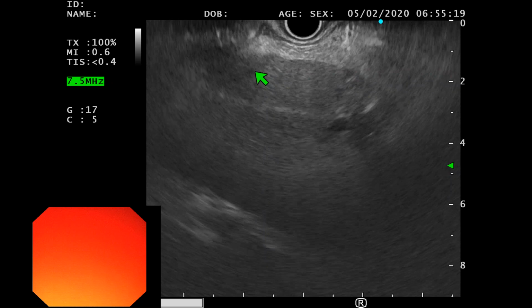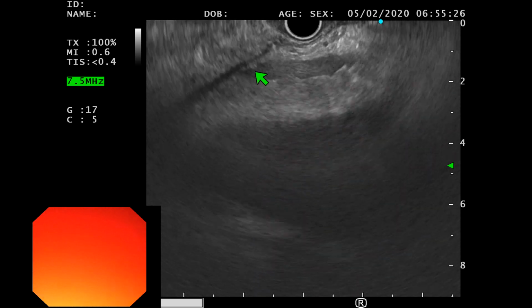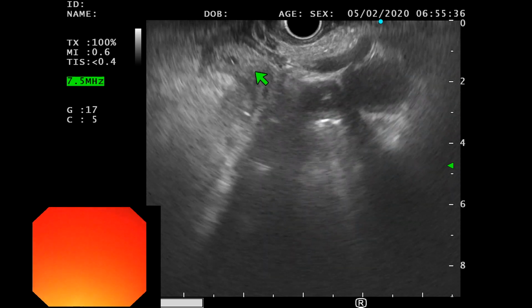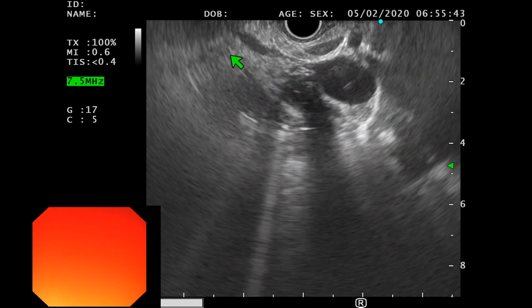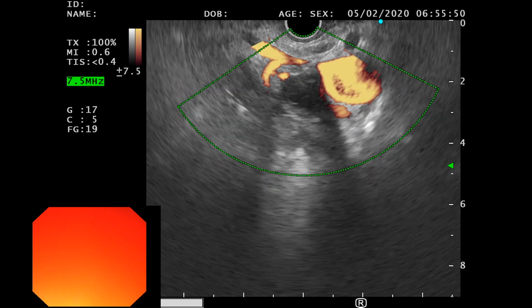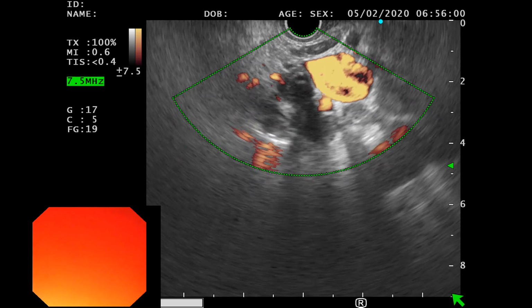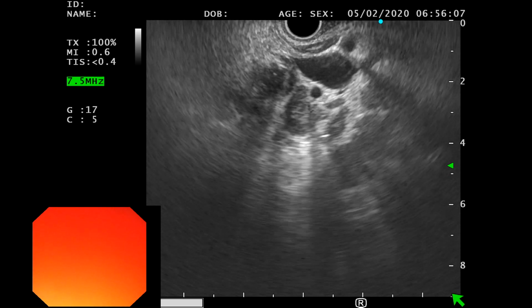We'll go back to the liver. You lost. So in the liver, when you're looking at the liver, we should be able to see the ductal system is dilated. Okay. Keep following the liver here. Keep going right. Keep going right. Okay. We have another lymph node here. So we've got one lymph node there. There's a lymph node there, but that's a not so, yeah. You see, yeah, look at this now.